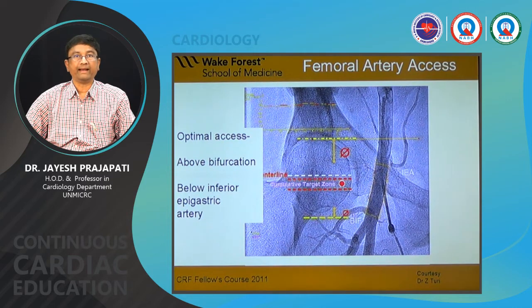Another thing is the bony landmark. Sometimes your pulse is feeble, as when you want to take peripheral vascular disease access. Then you have to take the bony landmarks. Take the femoral head as a landmark and divide it into 4 quadrants. The lower and inner quadrant should be your pricking site, and you have to keep that in mind.